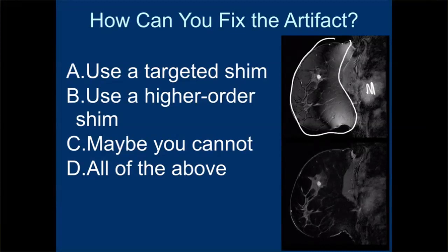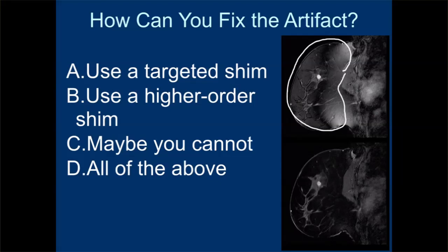Okay. I didn't realize that we actually did shimming explicitly. I just thought the scanner did it, was set up once, but do you actually have sequences that you can run to say shim it now? Yeah, a pre-scan would do shim, and sometimes in the graphical interface you can actually mark an area where you're going to target the optimization to shim better. Okay, I thought the pre-scan was just sort of fixed. Not necessarily. Definitely not on all systems.